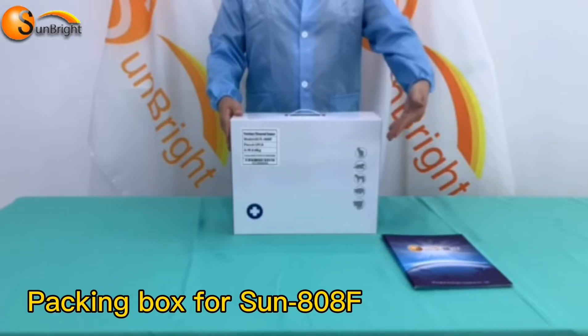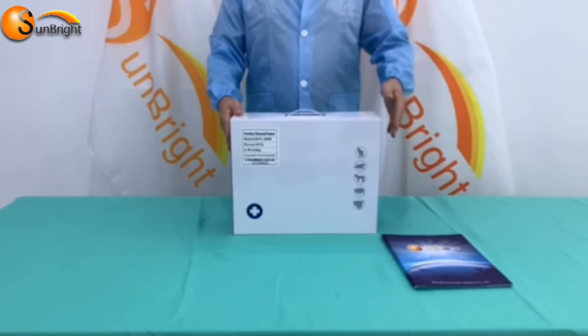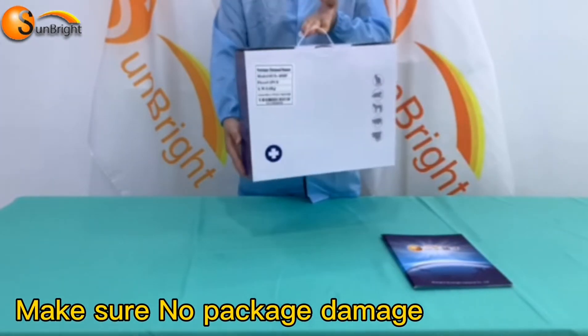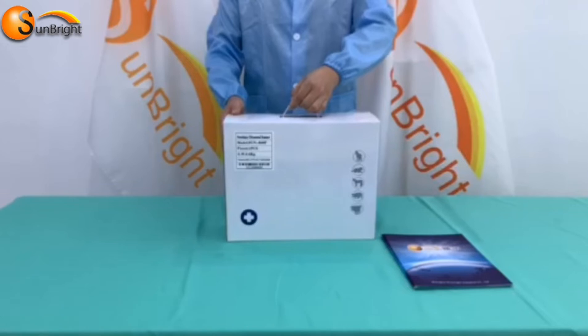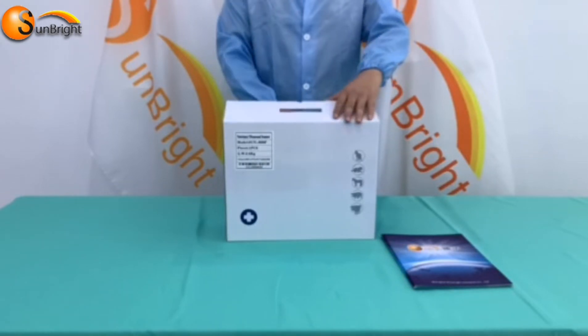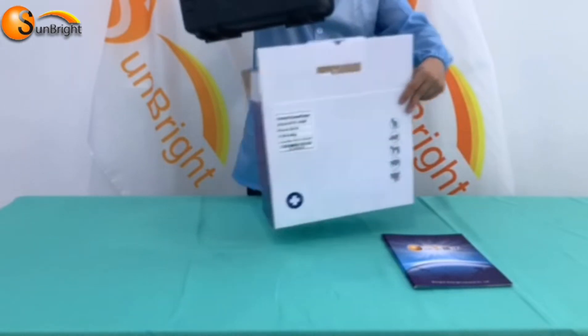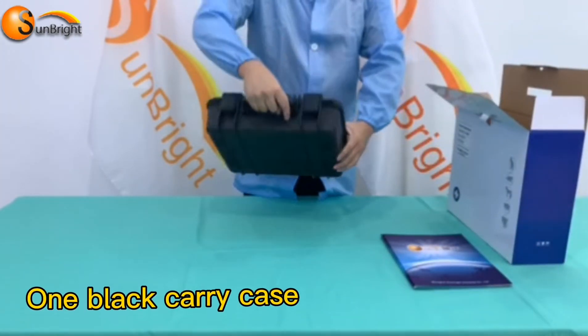This is the packing box of Ultrasound Machine Sun-808F. Check the outside package to make sure there is no shipping damage. Now let's open this packing box, and you will see one black carrying case.